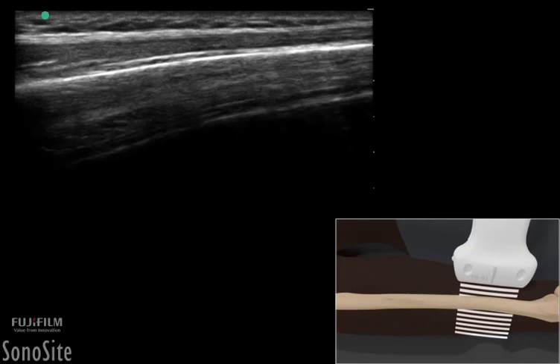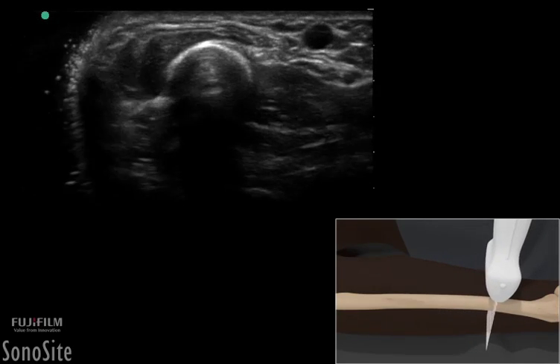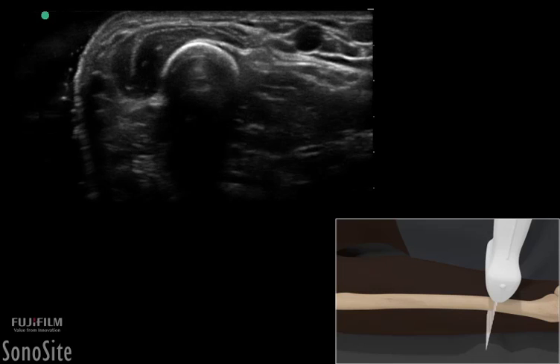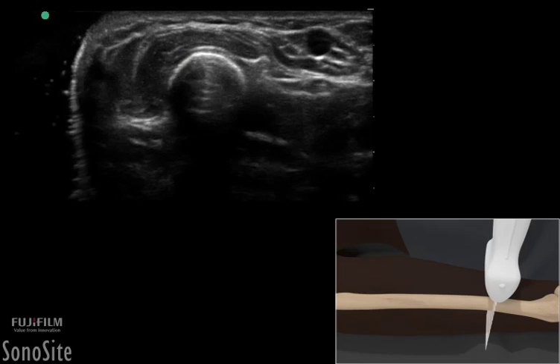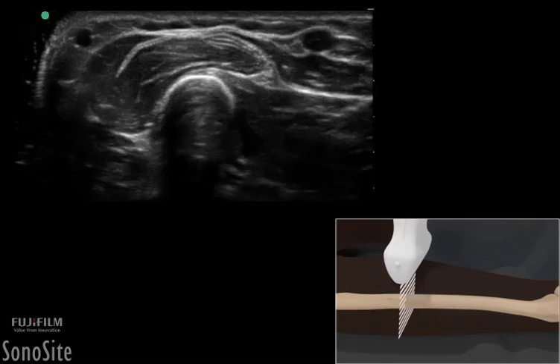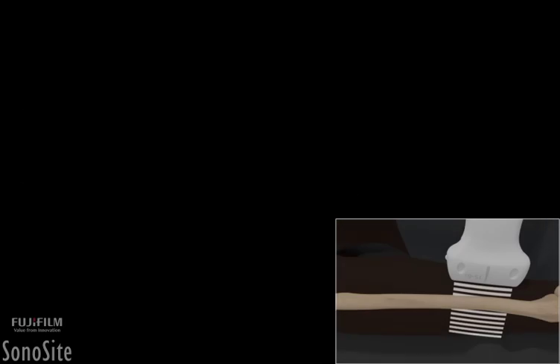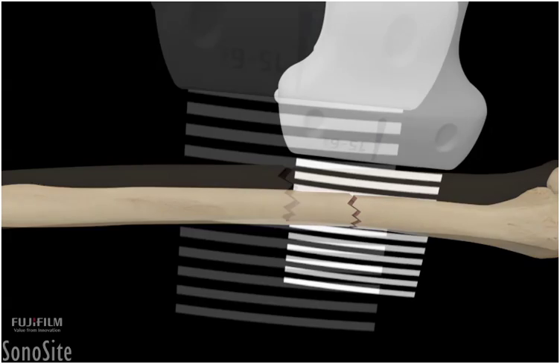The transducer should then be rotated 90 degrees counterclockwise with the orientation marker directed towards the patient's right side. The transverse section of the bone appears as a bright, hyperechoic circular or triangular shaped structure that gradually tapers in the distal bone. The ultrasound examination should be repeated longitudinally in the injured extremity.